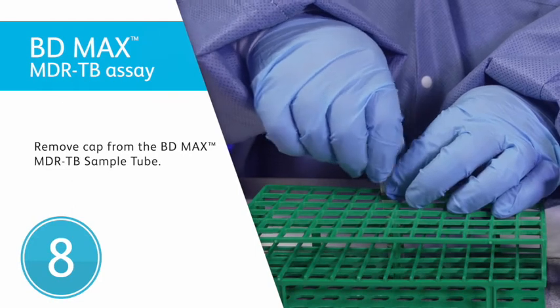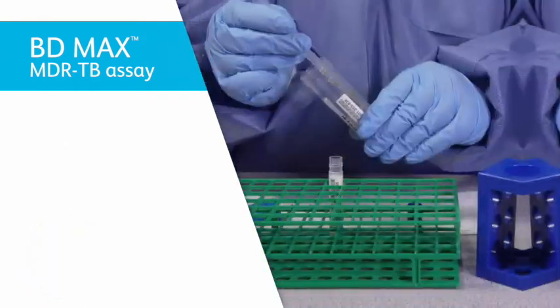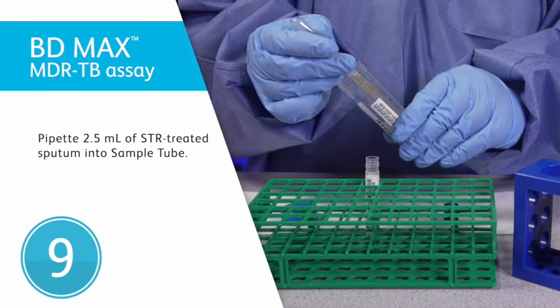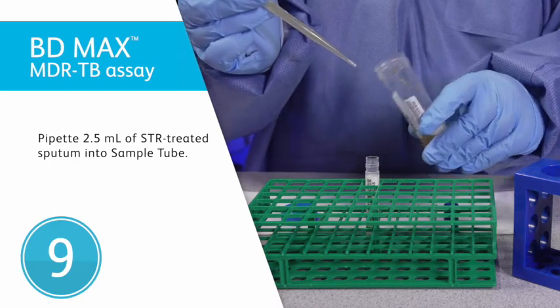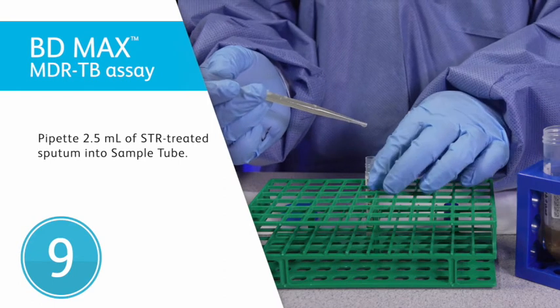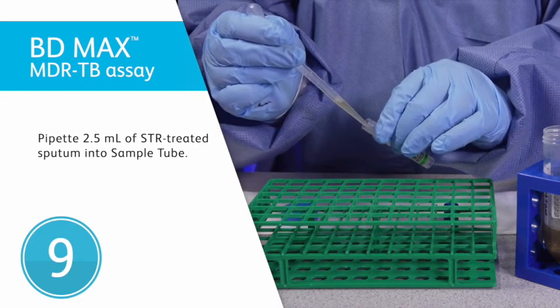Remove the cap from the BD-MAX MDR-TB sample tube. Using the pipette supplied, transfer 2.5 milliliters of the STR treated sputum sample to a labeled BD-MAX MDR-TB sample tube. Double check that the sample ID on the BD-MAX MDR-TB sample tube matches the label on the collection container.